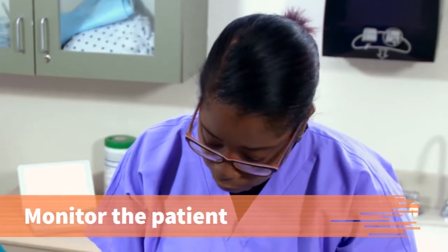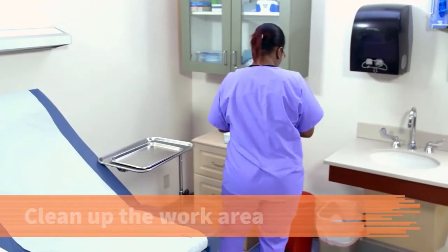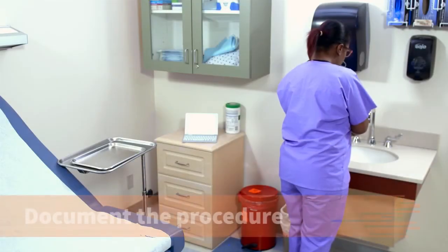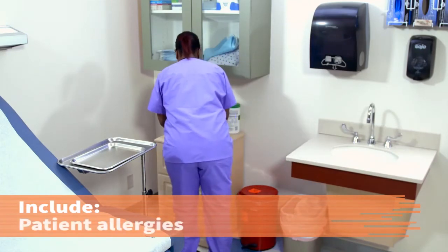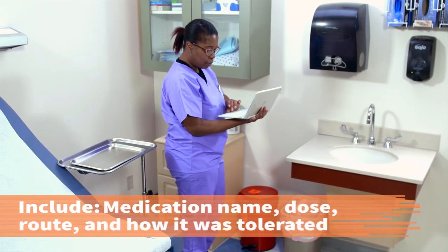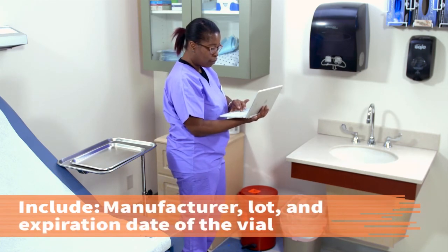Observe the patient for any adverse reactions. Clean up the area. Discard all waste, including your gloves, in the biohazard waste container. Sanitize your hands. Document the procedure in the health record. Include assessments done, patient allergies, teaching or instructions provided, the provider ordering the medication name, dose, route, and how the patient tolerated the medication. Also include the manufacturer, lot, and expiration date for vaccines.